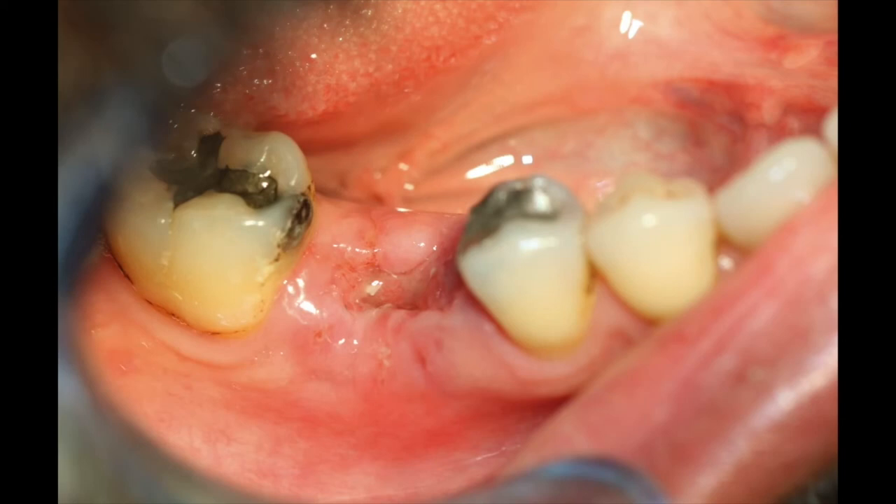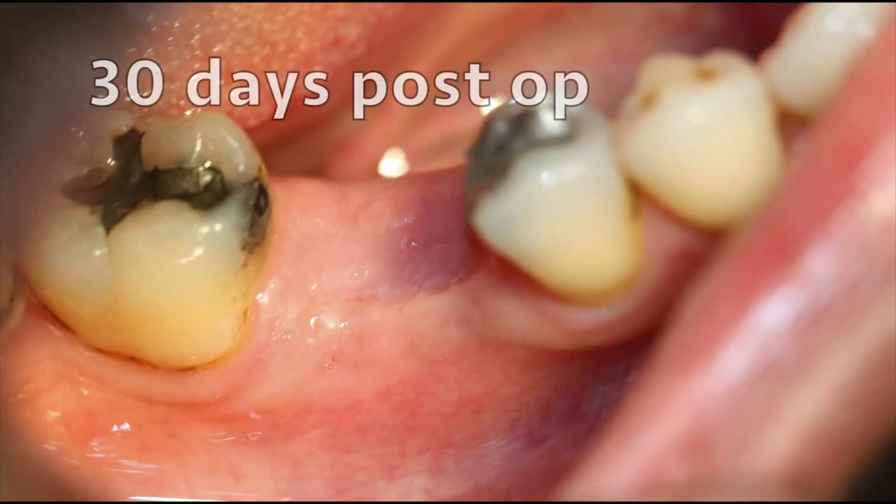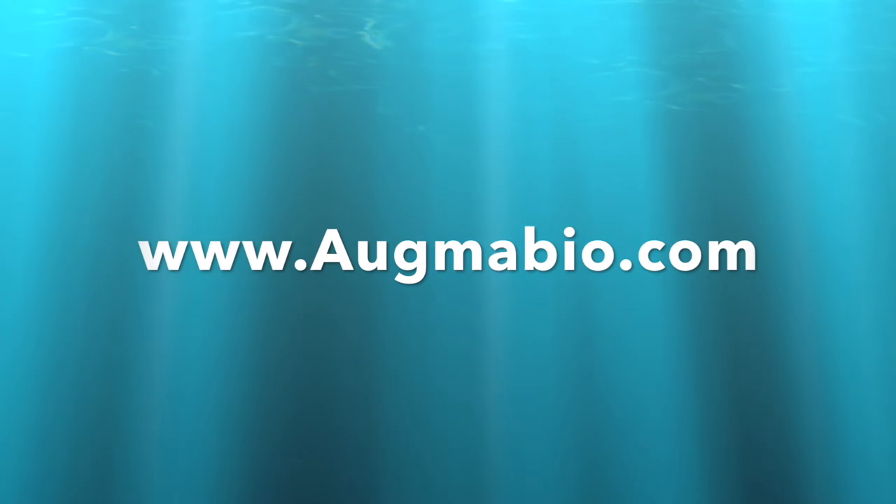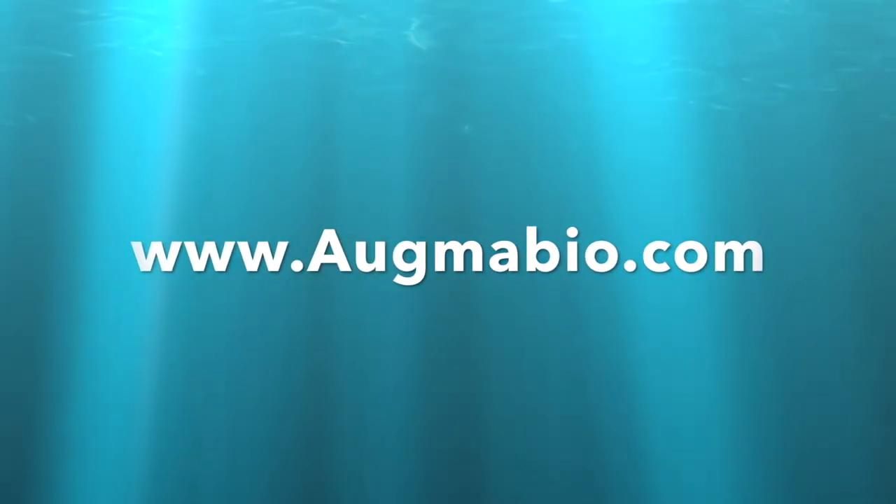The bacteriostatic nature of the graft also helps a lot here. After only 30 days, you can already see the maturation of the soft tissue beginning. At this stage you cannot place an implant — you should wait at least 3 months until the bone will form and maturate in the grafted site.